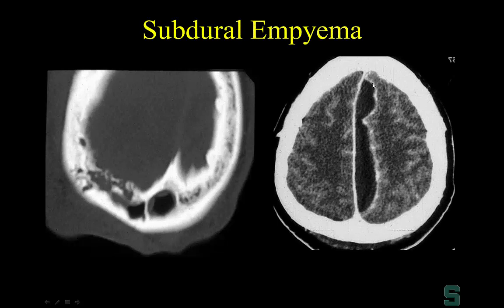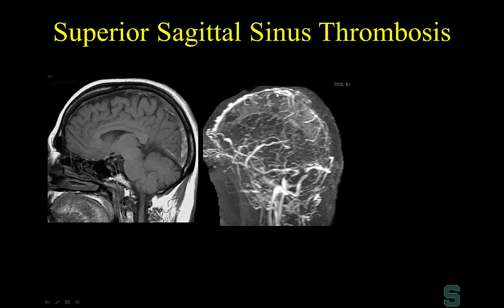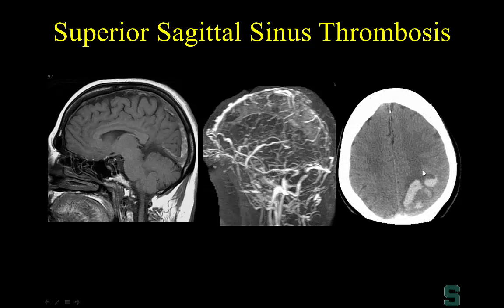With a large subdural empyema, you must examine the superior sagittal sinus running along the falx. T1 shortening indicates superior sagittal sinus thrombosis. An MRV demonstrates absence of flow in the superior sagittal sinus, and on axial images you can identify a large venous infarct involving the posterior aspect of the left cerebral hemisphere — a venous infarct due to superior sagittal sinus thrombosis.